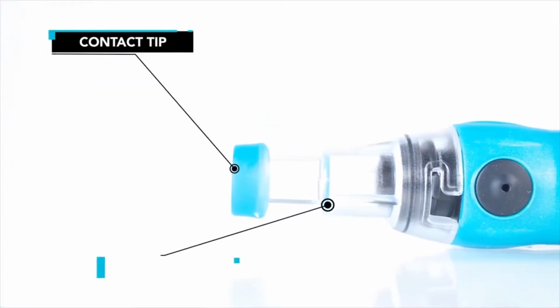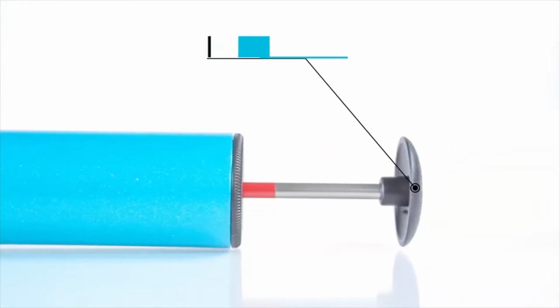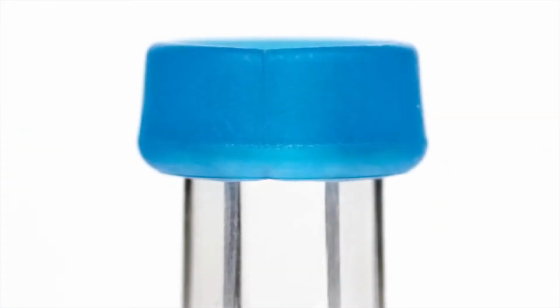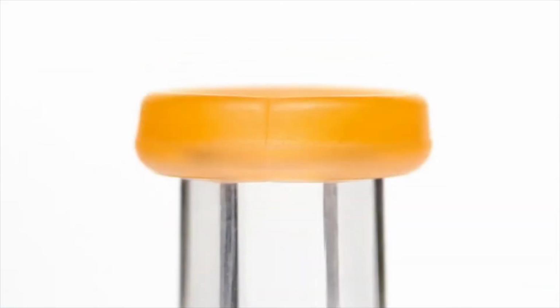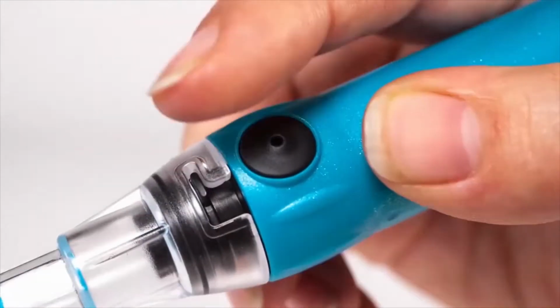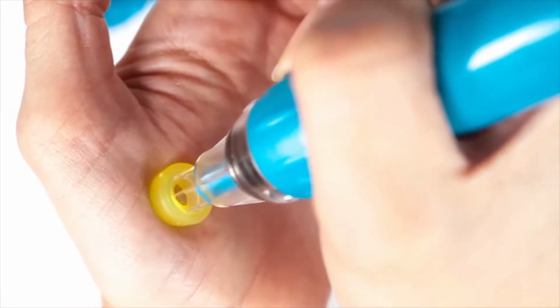Genteel has 4 major parts to accomplish this: contact tips, a nozzle, the activation button, and plunger. Genteel limits how far the lancet can go into your skin by using its 6 different contact tips that have different penetration depths. A contact tip is secured to a nozzle. The activation button and plunger push the lancet into the skin and maintain the vacuum that forms the drop of blood.